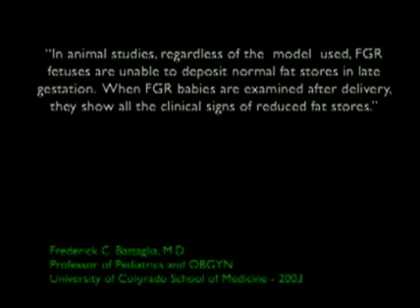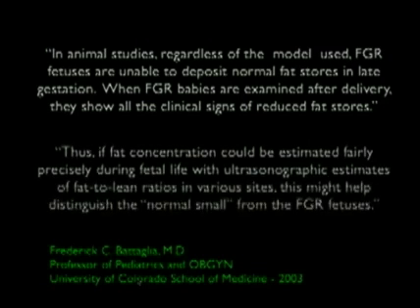And then Dr. Fred Battaglia from Colorado was quoted as saying in another publication, in animal studies, regardless of the model being used, fetal growth restriction fetuses are unable to deposit normal fat stores in late gestation. When FGR babies are examined after delivery, they show all the clinical signs of reduced fat stores. Thus, if fat concentration could be estimated fairly precisely during fetal life with ultrasonography of fat to lean ratios in various sites, this might help distinguish the normal small from the FGR fetuses.